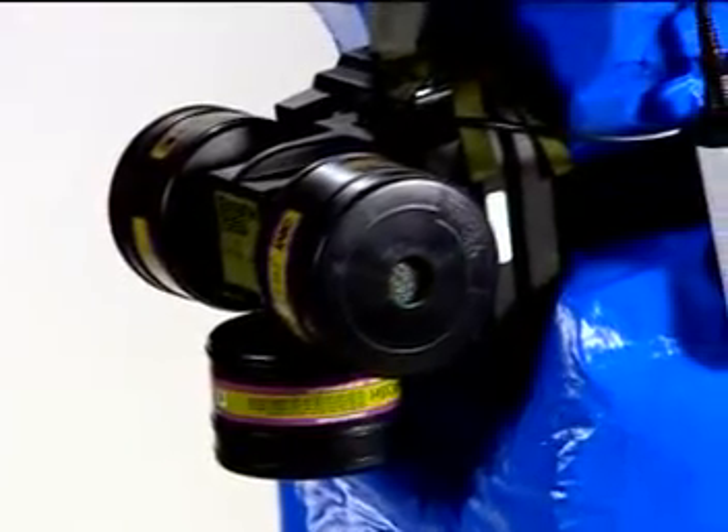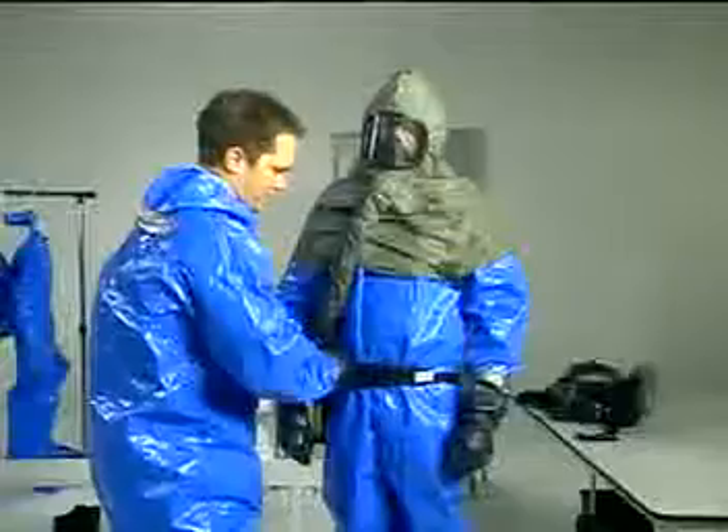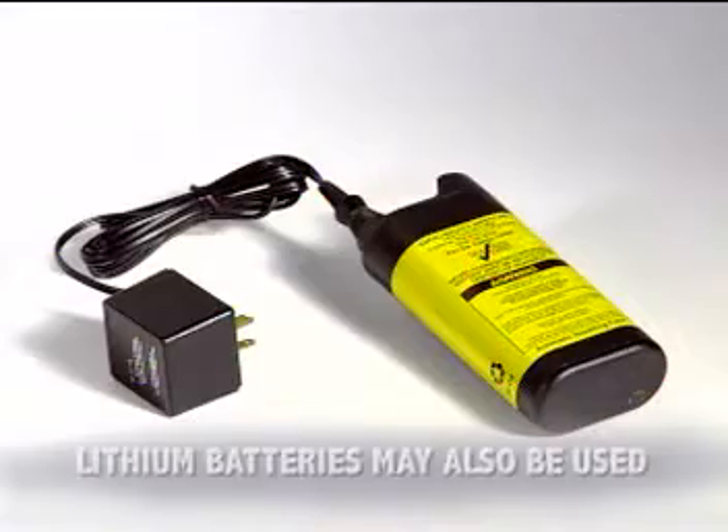The PAPR will also include a belt-mounted turbo unit with a battery pack and filter cartridges, and a breathing tube connecting the turbo unit to the facepiece. A battery charger is used to keep batteries fully charged when the respirator is stored.